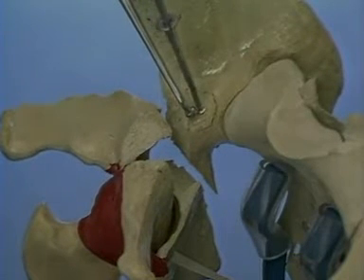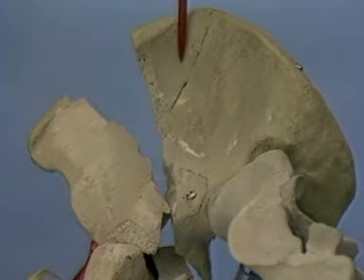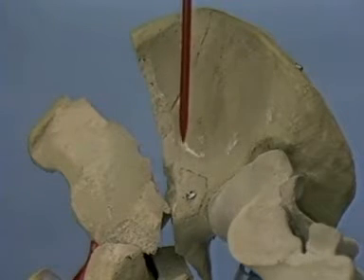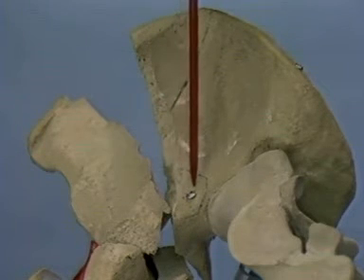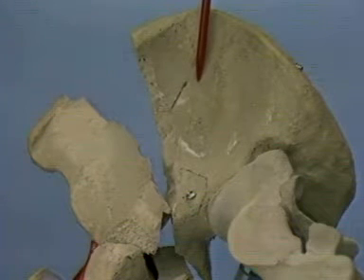After measuring the depth, the screw is inserted. Even though these two fragments are extra-articular, their precise reduction is essential for a final correct reduction of the joint.